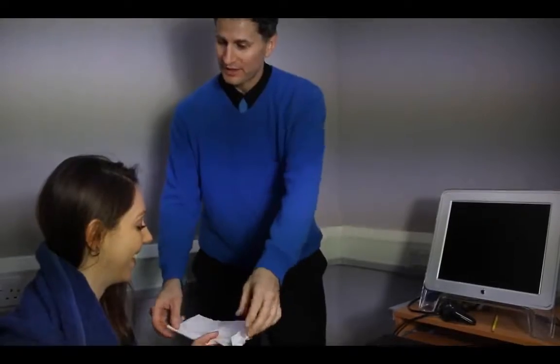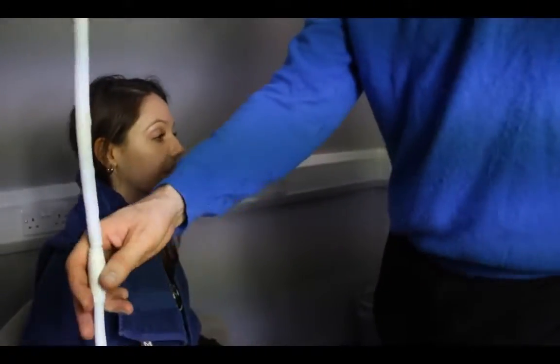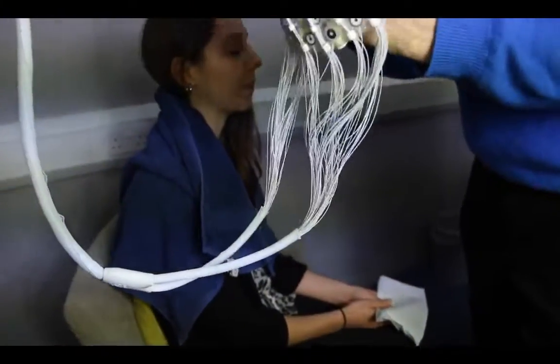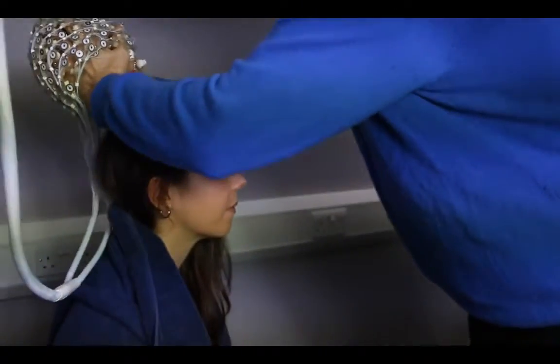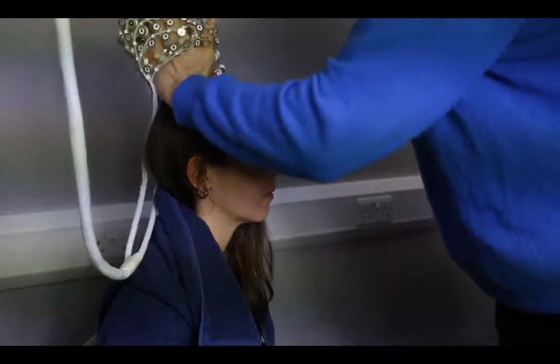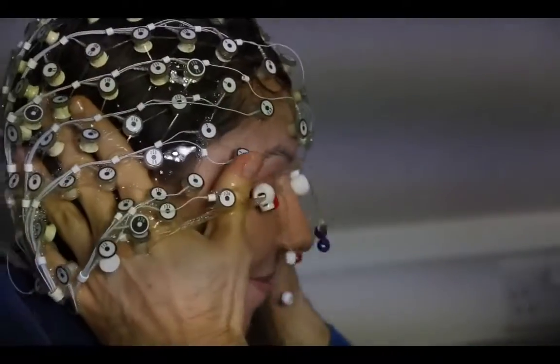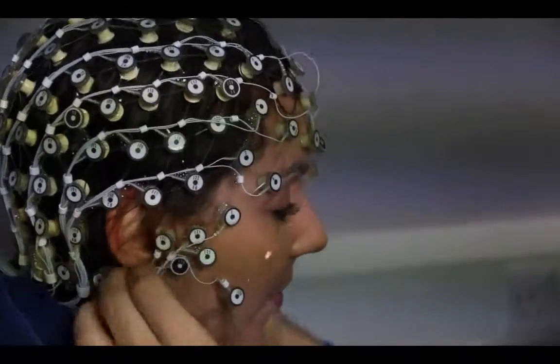Our third step in this last phase is placing the EEG cap on the participant's head. To do so, you want to spread your fingers on either side of the cap. There's an electrode right in the middle of the cap called CZ. You want to place this directly on the X which you made previously. This is a very important step. As you bring the cap down around the participant's head, you're going to bring the straps under the chin. And there are 2 holes in the cap which you can adjust underneath the participant's ears.